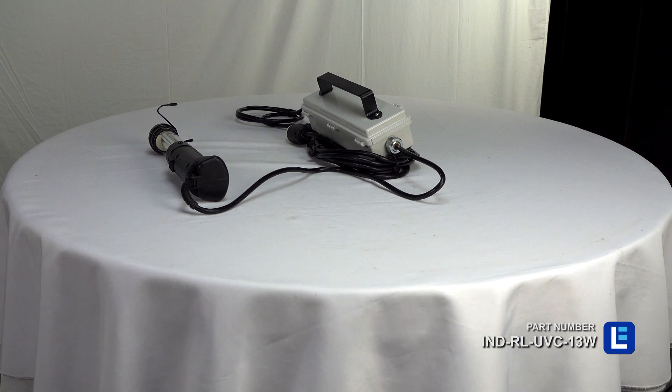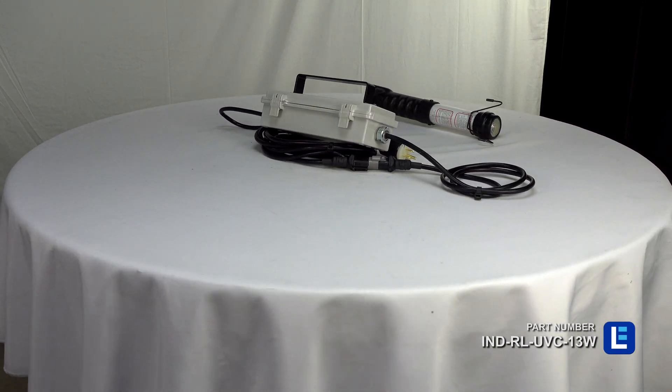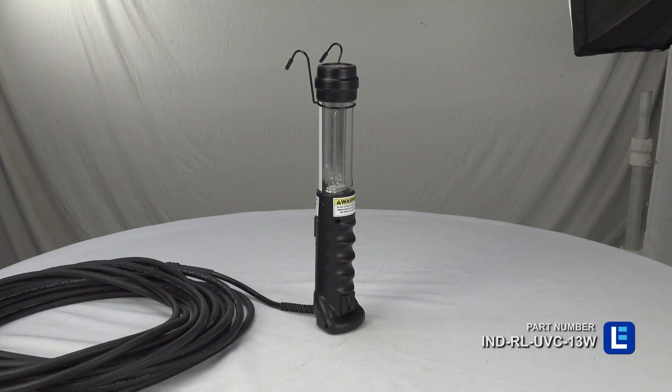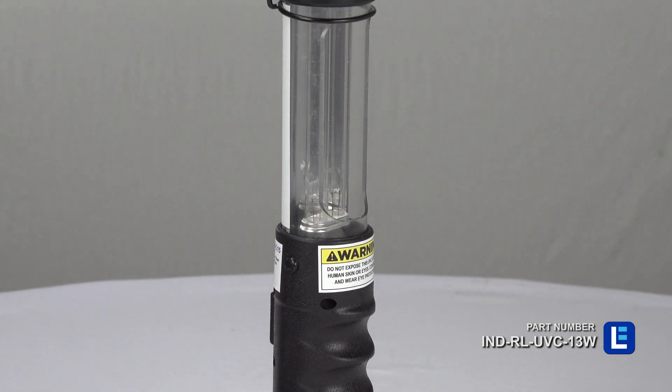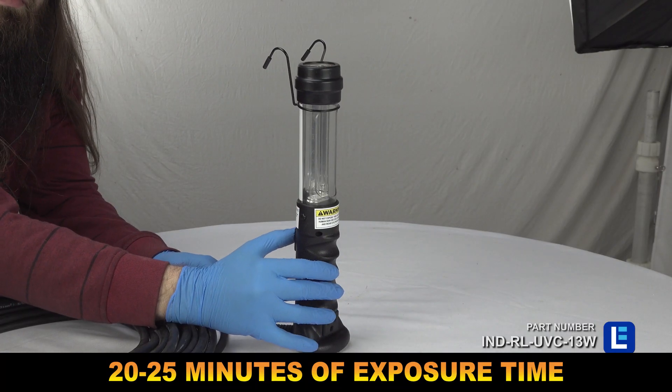The Larson Electronics IND-RL-UVC-13W is a rechargeable UV disinfection hand lamp which can disinfect viruses and bacteria found on tools, equipment, and surfaces. Powered by a NIMH battery, this unit offers UVC output at a range of 200 nanometers to 280 nanometers.